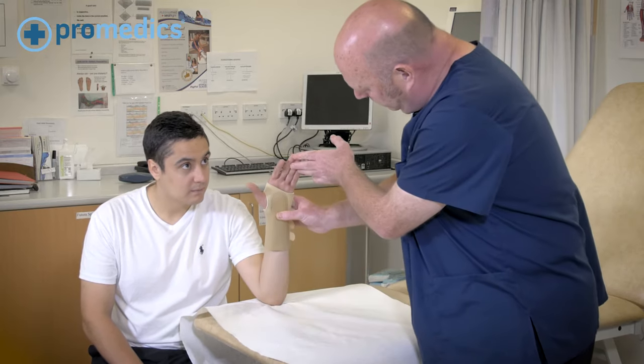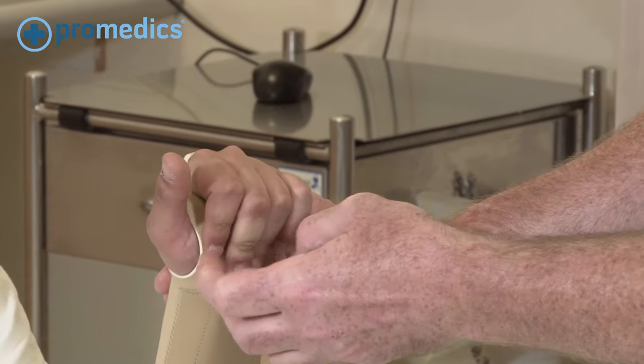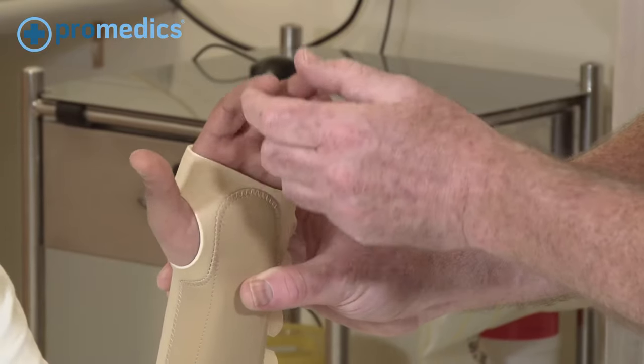Just recheck, and as you can see it's lowered down, which enables good flexion at the thumb, so it makes it much more comfortable for the patient.